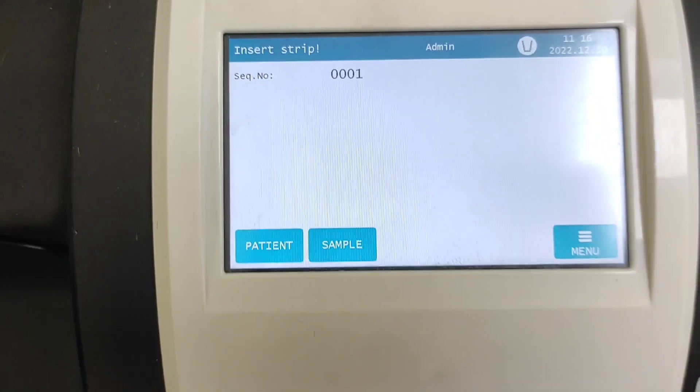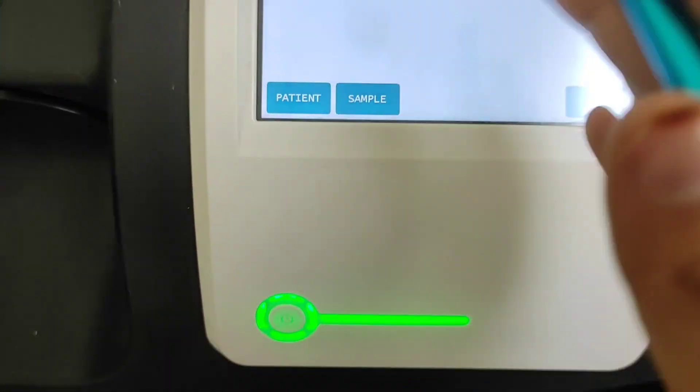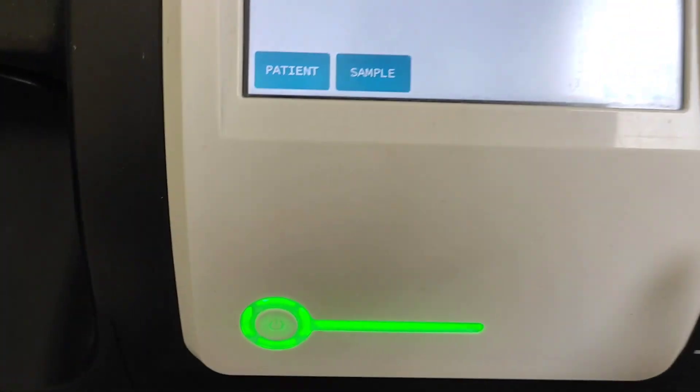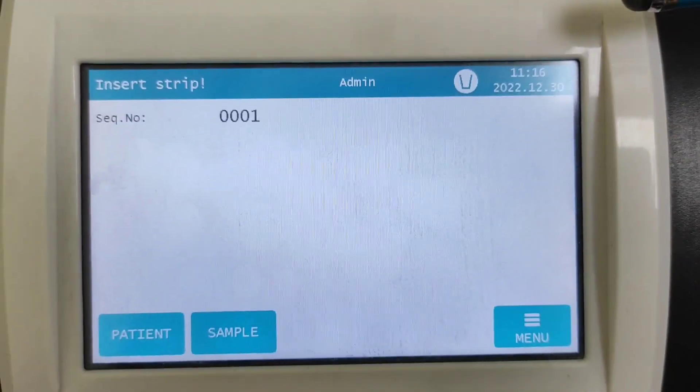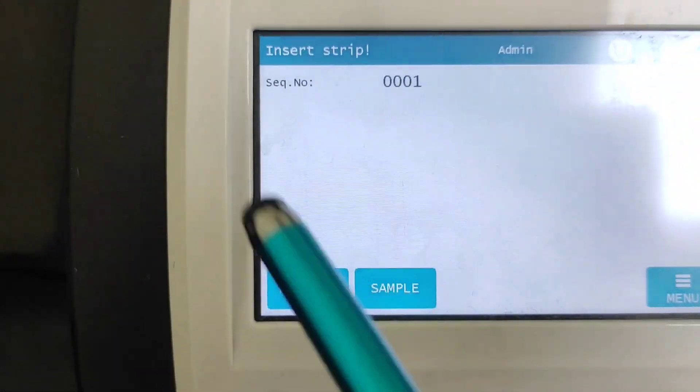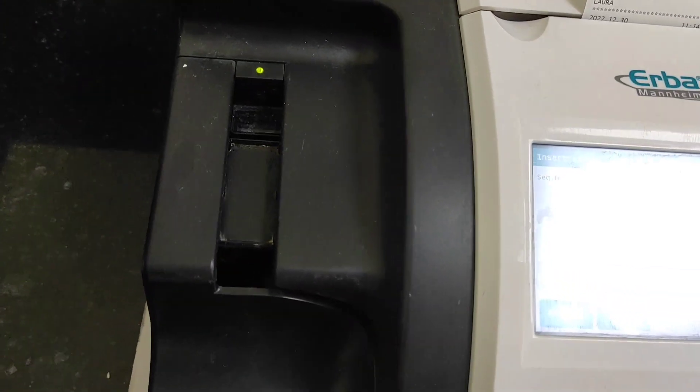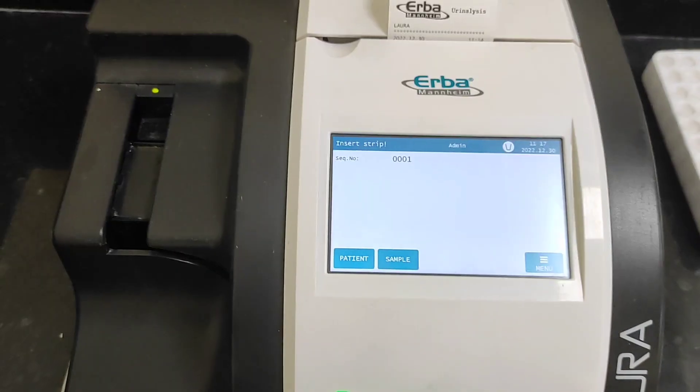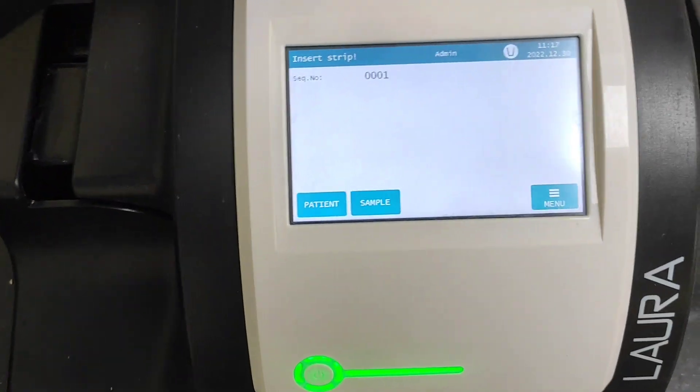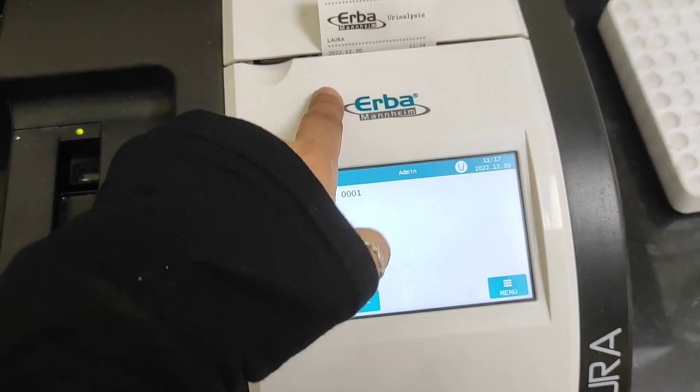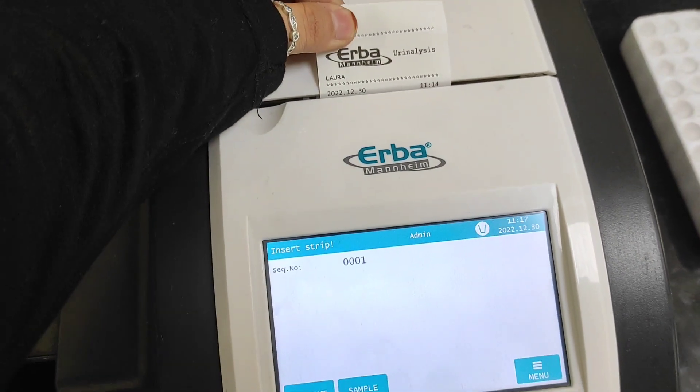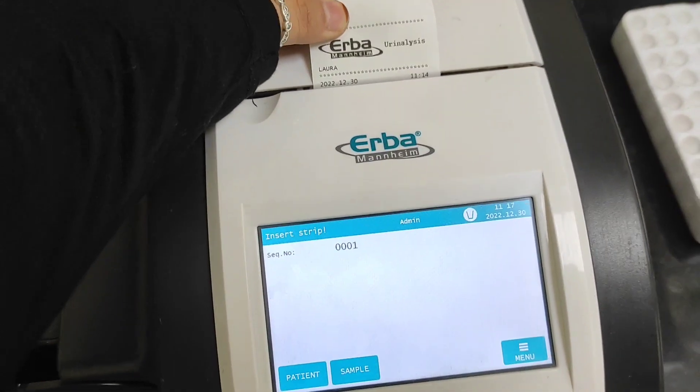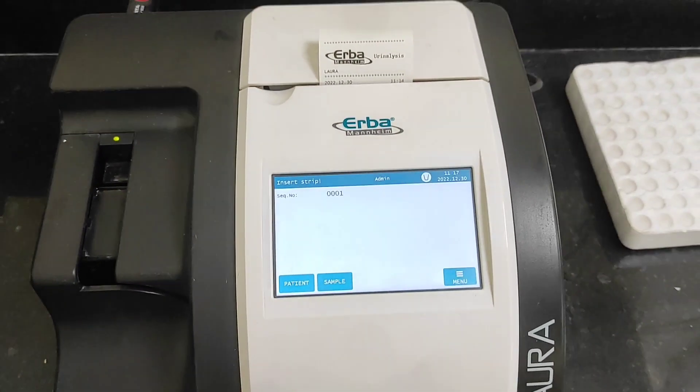And now it's just saying insert the strip. So this is it guys. And yeah one more thing, here is a printer. The printer part, you can just get the result in the form of print. So this is it guys, it was a brief introduction about this analyzer.